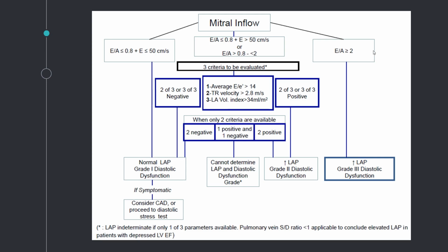Okay, so there is a new study that came out of Mayo Clinic in the last 2 months. I don't really recall the details, but they used two parameters of left atrial strain, I think called reservoir strain and pump strain of the left atrium, which apparently seems to have some correlation with invasive left atrial pressure. So that could be a potential emerging new tool that we might use in the future that could help differentiate. Yep. The LA strain is a big topic. I think it's not in the guideline yet. We recently had a journal club on this one at the Canadian Society Echo, and it is showing some promise, but not all our machines can do it at this point.